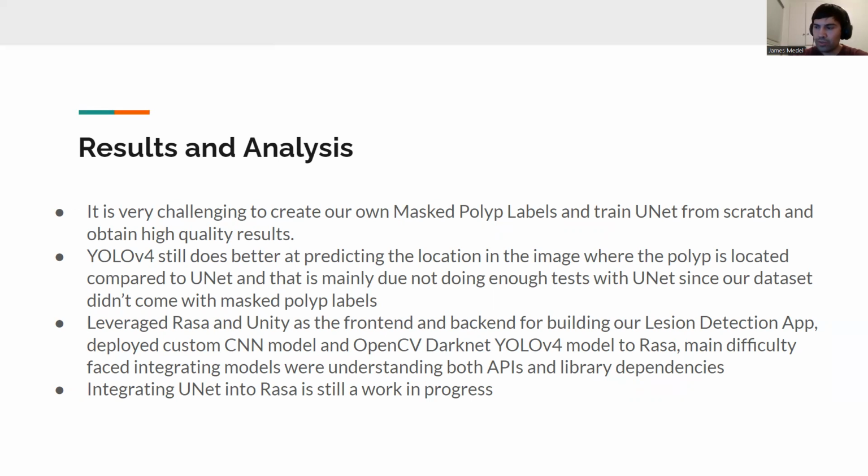It would help to have tools we can use to automate masking images for segmentation models, and I know those are in the works with technology such as MONAI. And then another area here is comparing YOLO object detection to UNet segmentation.